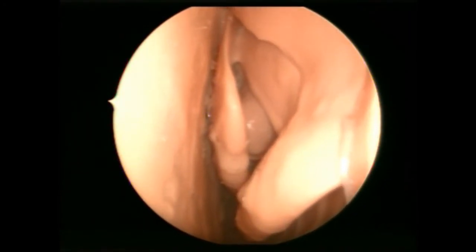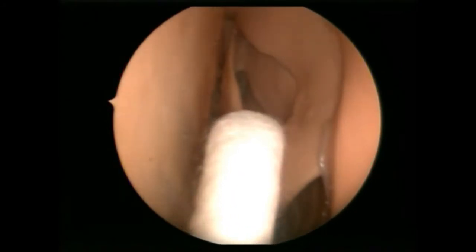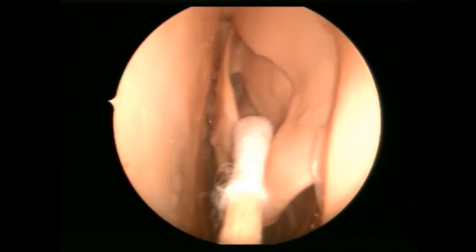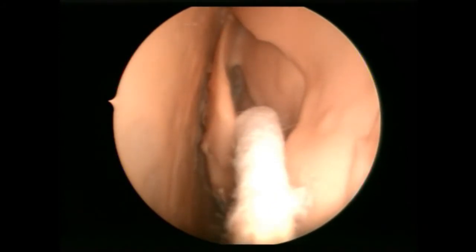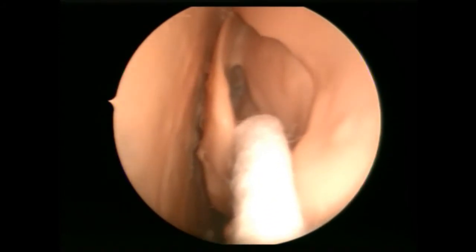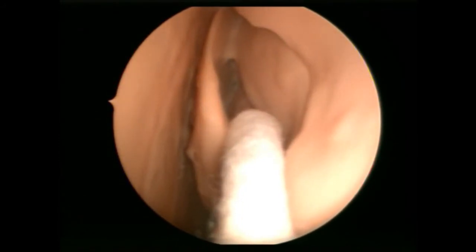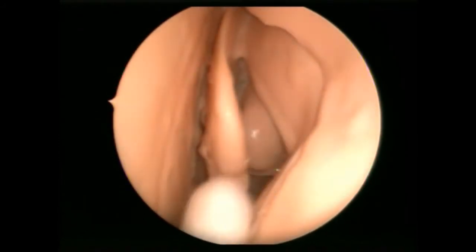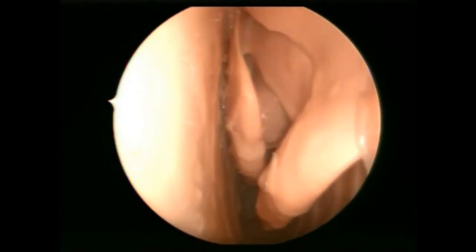cultured using the culture swab, which is demonstrated right now. So the culture swab goes in, and we need to keep it where the pus is. For example, if it's in the middle meatus, for at least 10 seconds, so the purulent secretion will be embedded into the swab. Then easily we take the swab out and put it back into the culture media.